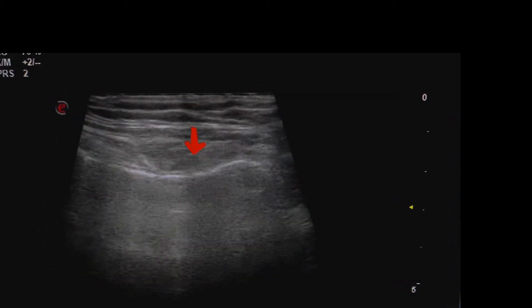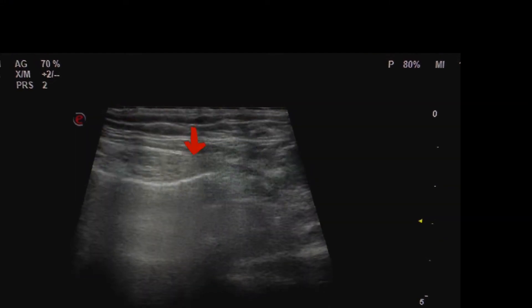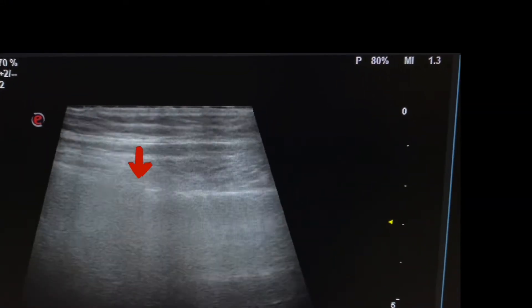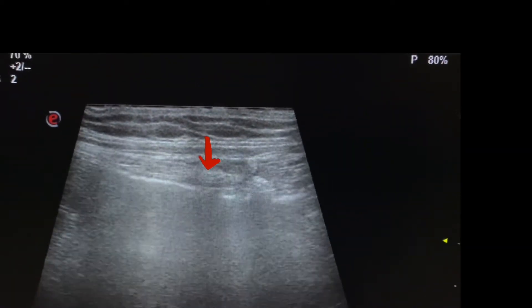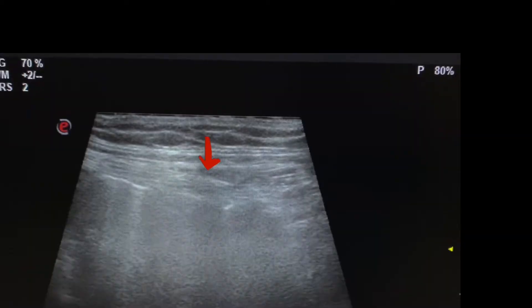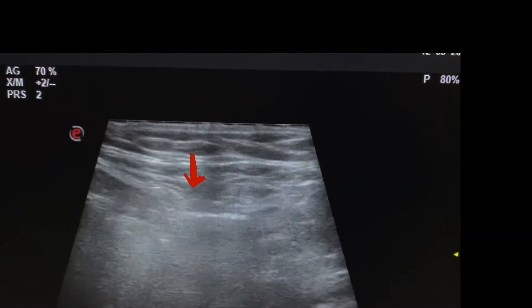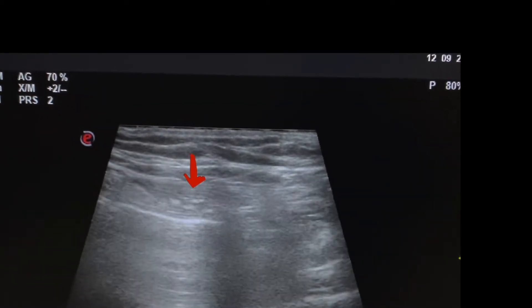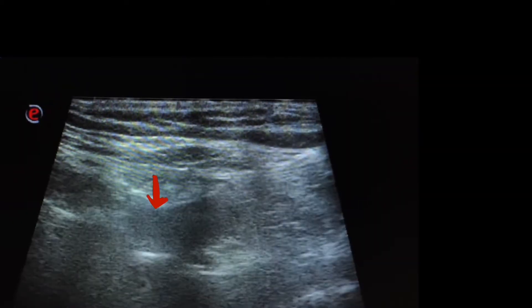Here we see an echogenic line — this is gas in the small intestine. In the small intestine, gases appear as a thin echogenic line. Now we are scanning the left inguinal area, as the patient is also complaining of swelling here.